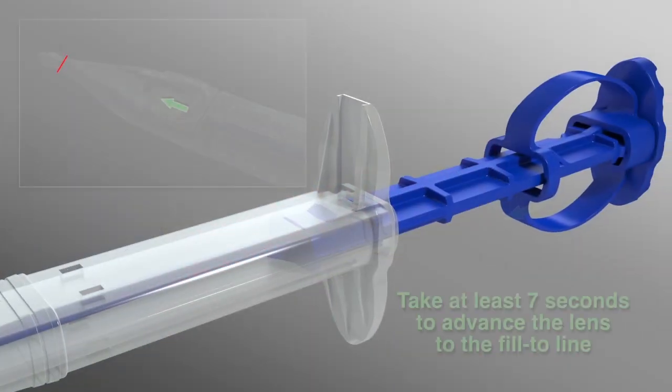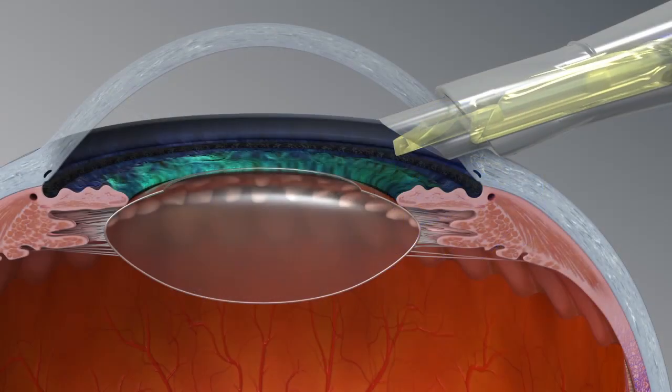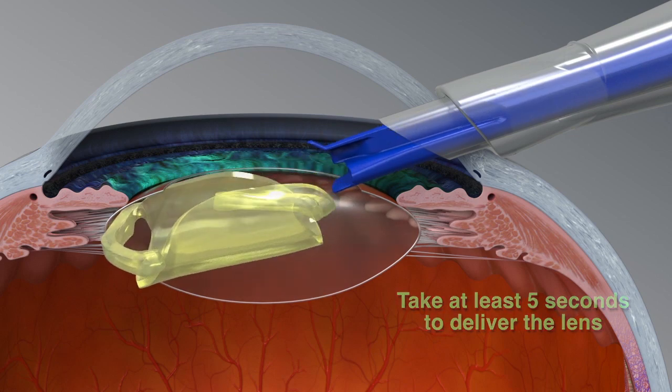Finally, please remember: take at least seven seconds to advance the lens to the fill-to line, and take at least five seconds to deliver the lens, to avoid lens damage.